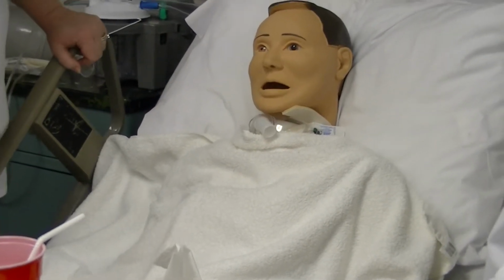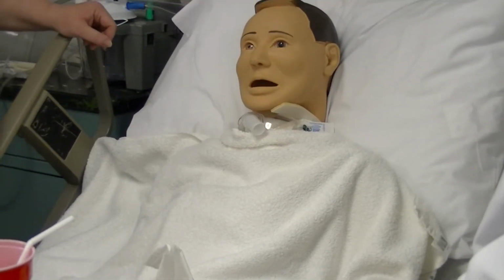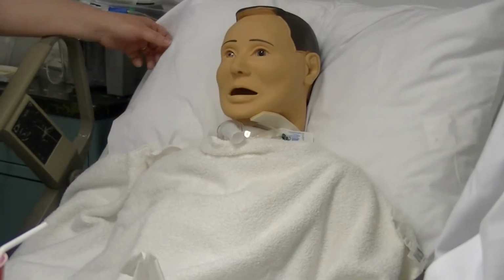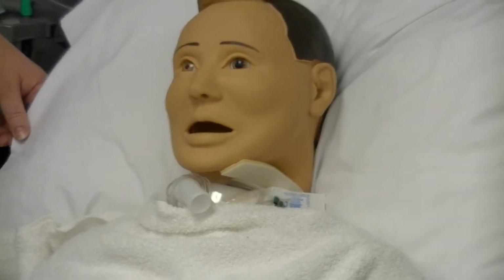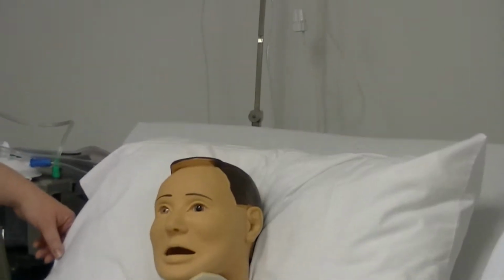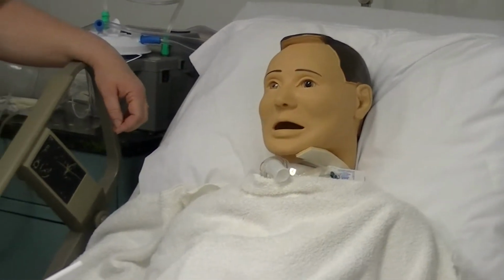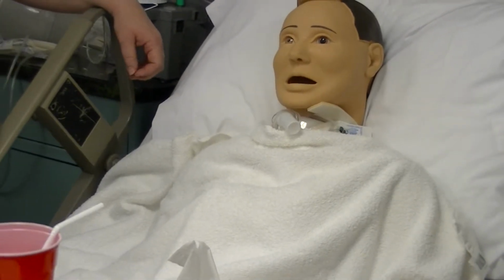All right, Mr. Jones. The nurse is then going to tell the patient why he is having the procedure and what procedure we are going to be doing. We are going to be inserting a tube through the nose down into the stomach for feeding purposes. There are other reasons why we will insert an NG tube, such as a bowel obstruction, gastric decompression, tube feedings, such as for this demonstration, administration of contrast, and relief of symptoms.